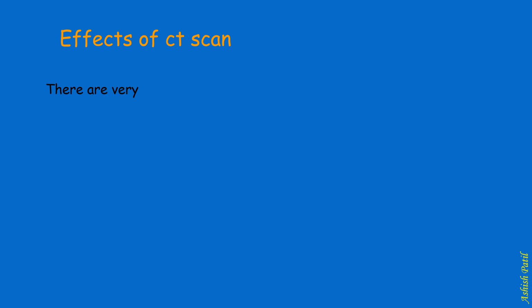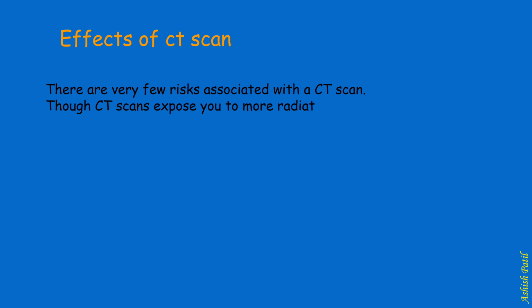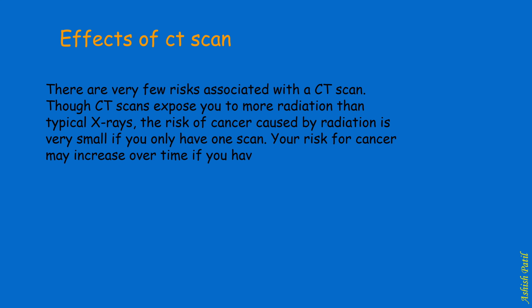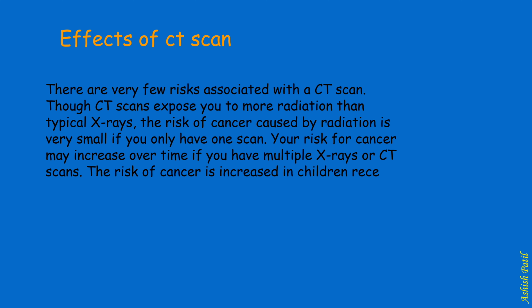There are very few risks associated with a CT scan. Though CT scans expose you to more radiation than typical X-rays, the risk of cancer caused by radiation is very small if you only have one scan. Your risk for cancer may increase over time if you have multiple X-rays or CT scans. The risk of cancer is increased in children receiving CT scans.